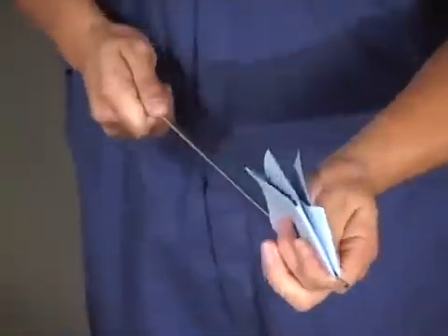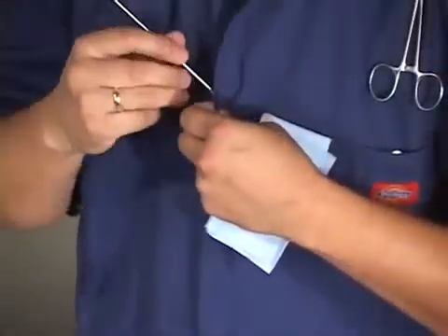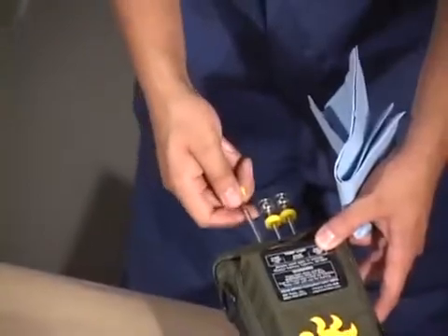While thawing the straw, pre-warm the AI gun by rubbing it with a paper towel and keeping it inside coveralls or a shirt, or place it inside the gun warmer.